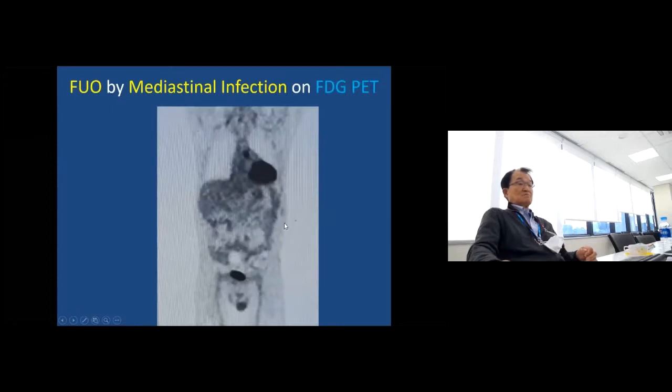So it's one of the cases because of myocardial activity. And if you see brain, that's FDG. If you see only the myocardium, you can think about sestamibi and thallium, that kind of thing. Now here we have a focal increased activity in the mediastinum that was proven to be a small abscess, unexpected.